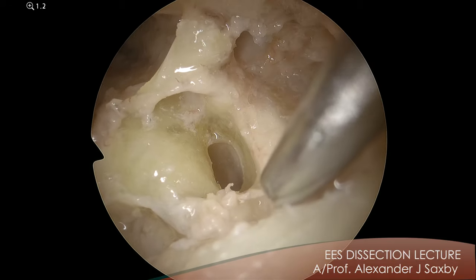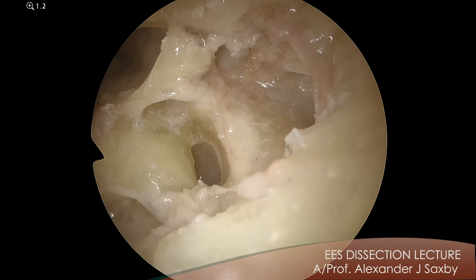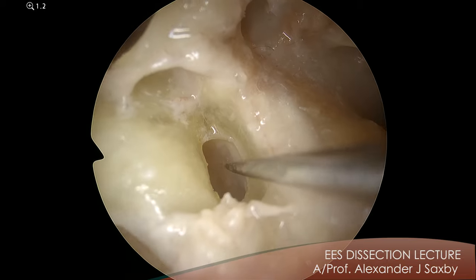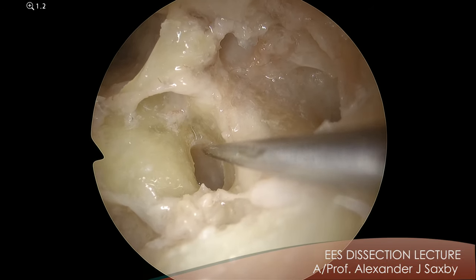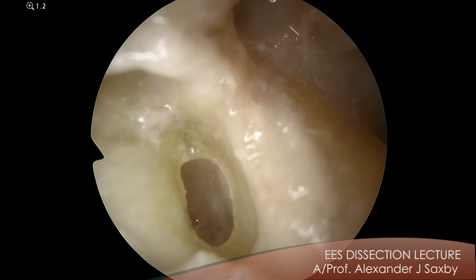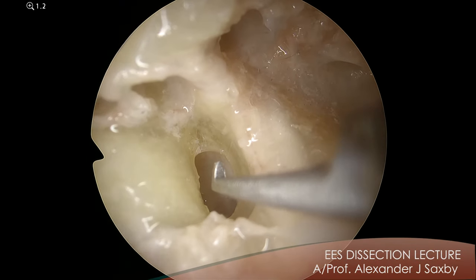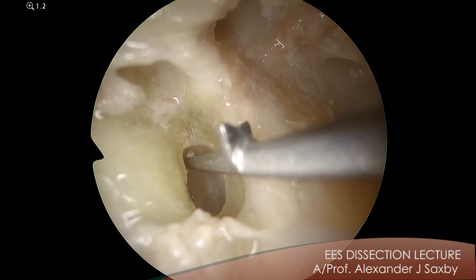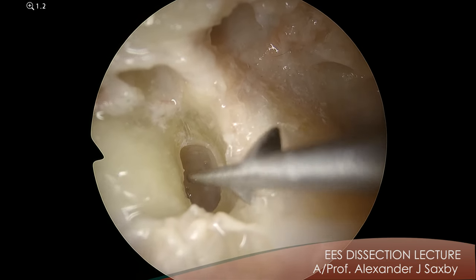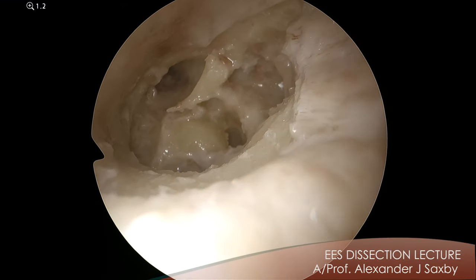Very gently sucking inside here so we can have a look. Sometimes you can still see the saccule and the utricle. Yes — here's the utricle here. And here is the saccule here. So you can see that when you put your stapes piston, if you place it in the center, you're less likely to hit any of those structures. This soft tissue here is the saccule. This soft tissue here is the utricle. And this direction will be the cochlear duct. So the next thing I recommend to do is to join the round window and oval window.